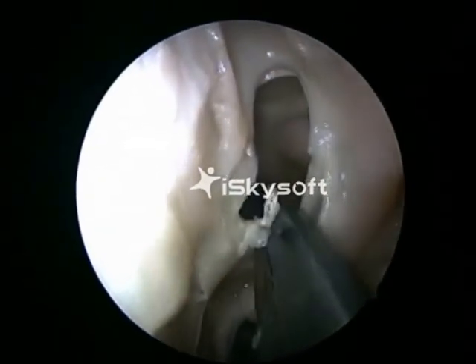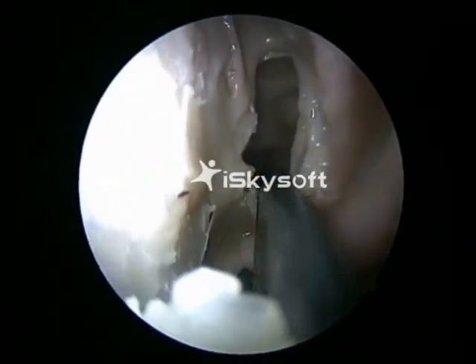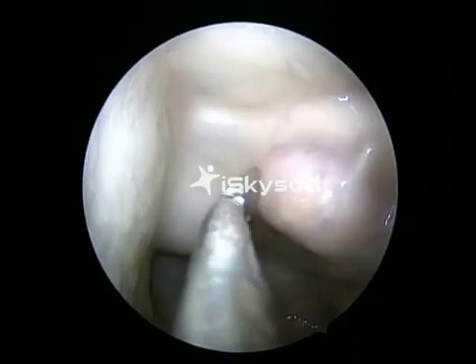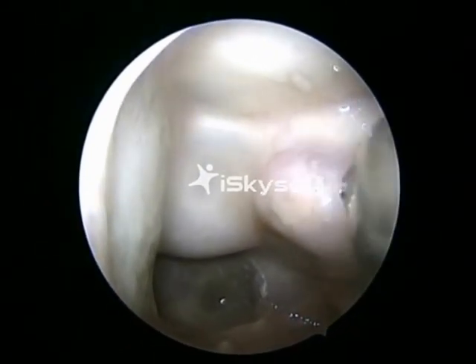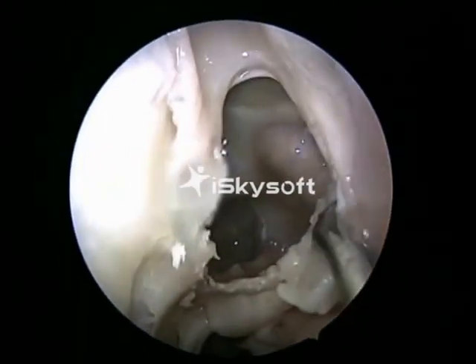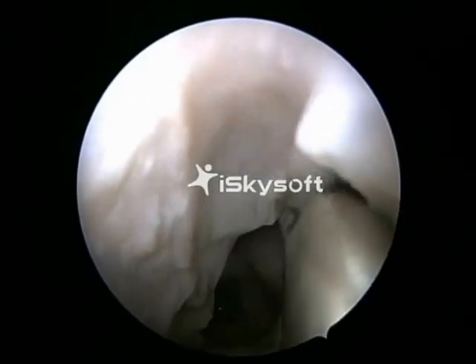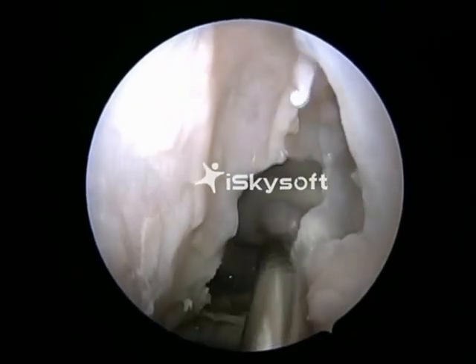The next step would be to widen the sphenoid sinus ostium on the left side inferomedially. That's the internal carotid artery. That's the sella, the optic nerve. Maximal exposure should be achieved for dissection of the tumors in the pituitary. We believe in a 1.5 exposure, a cavity and a half.